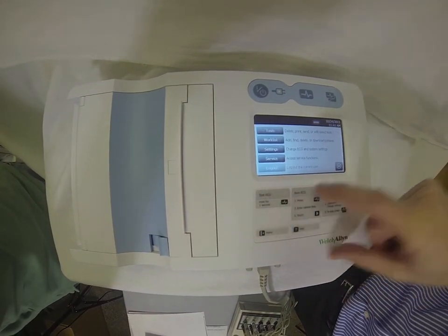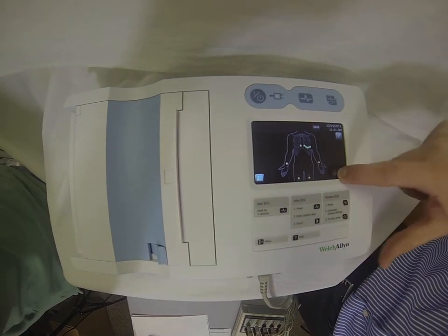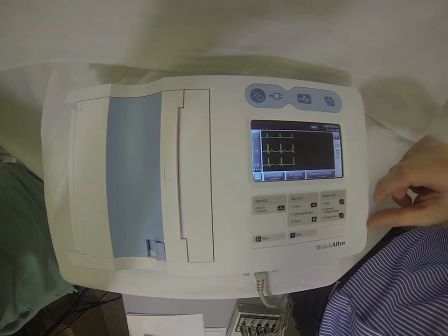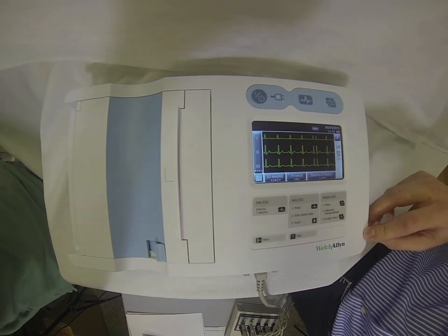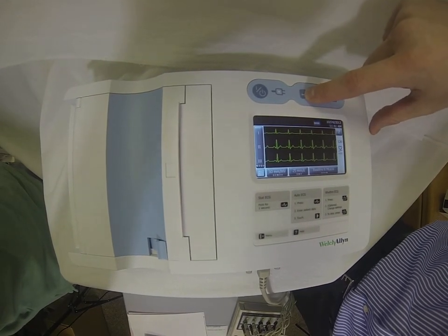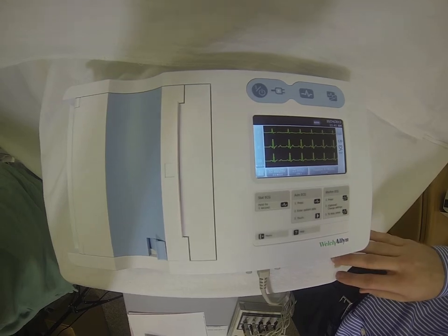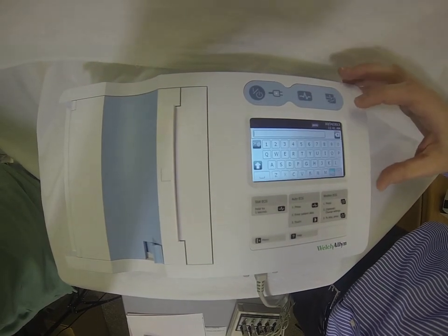In order to capture our test, all we're going to need to do is hit the Auto ECG button at the top. Hit that and it's going to ask us for some basic patient demographic information.